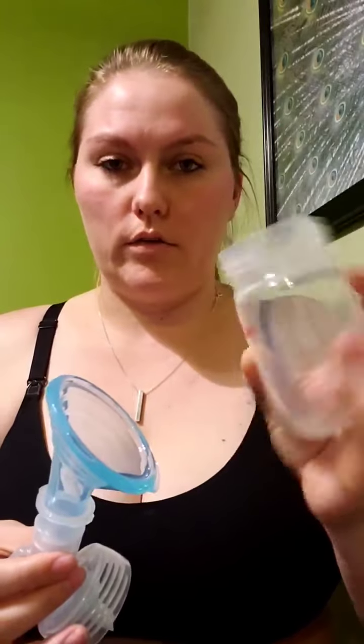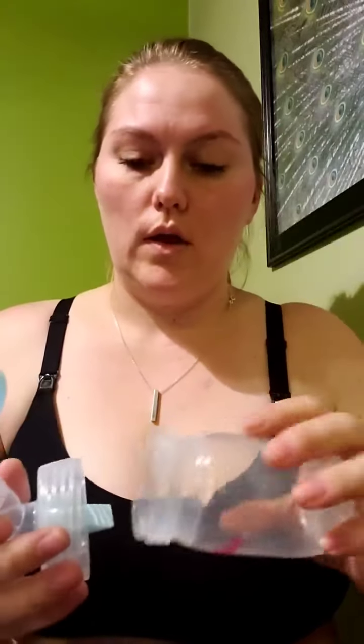Then take your Spectra wide mouth bottle and stick it on there like you normally would. When you turn on your pump, you want to use the expression mode, not the massage mode. You want to use the expression mode on the lowest cycle setting of 38.